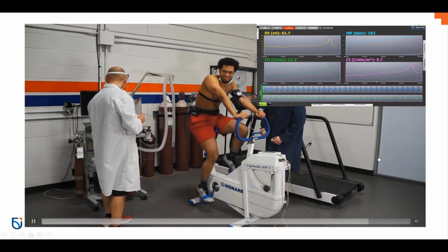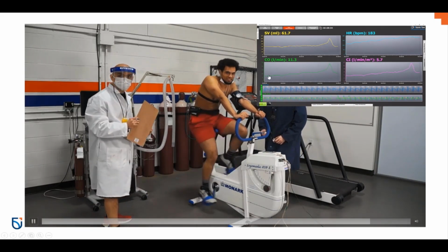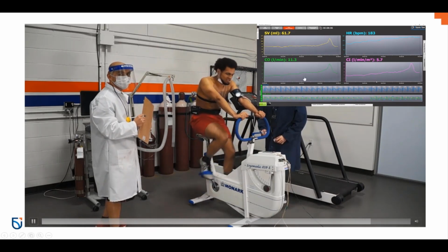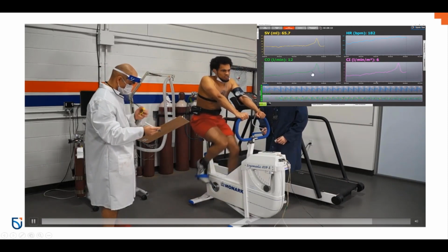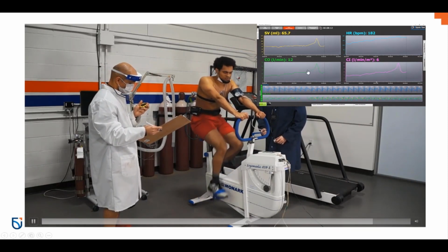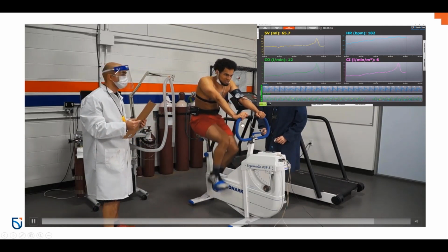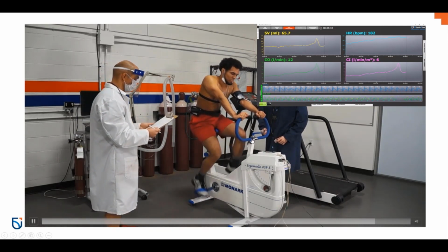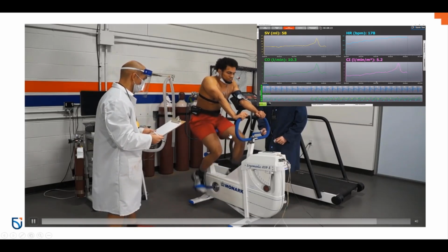It's pretty close. We definitely see that we have a steady increase in heart rate that corresponds to the original ramp, and then as we see stroke volume really start to ramp up, that multiplying effect on cardiac output, you really start to see cardiac output ramp way up. But unfortunately his legs just couldn't necessarily grasp that wattage because he's not used to cycling a ton.